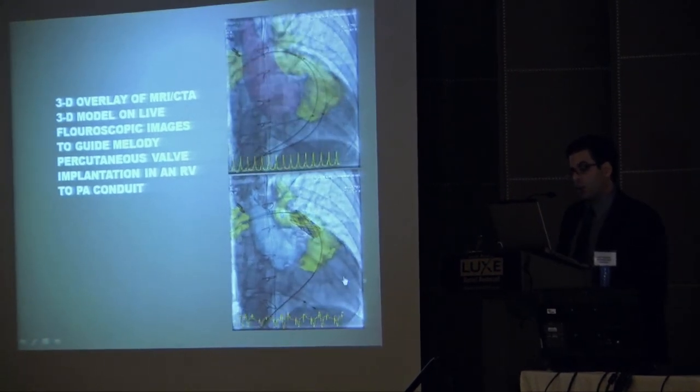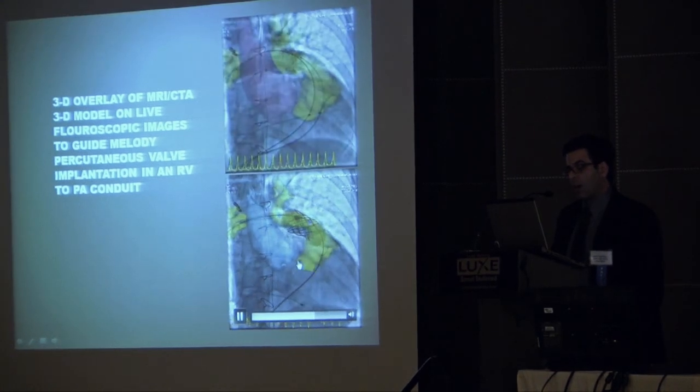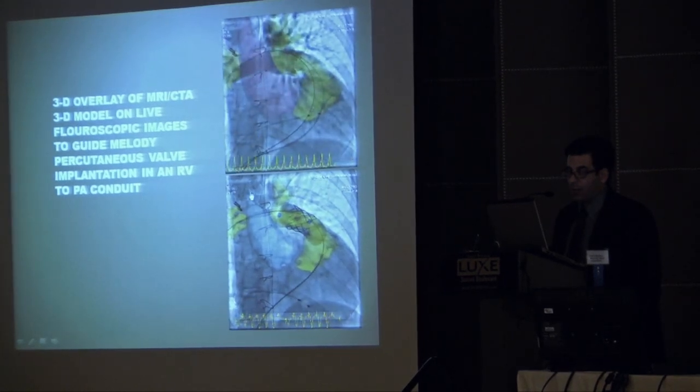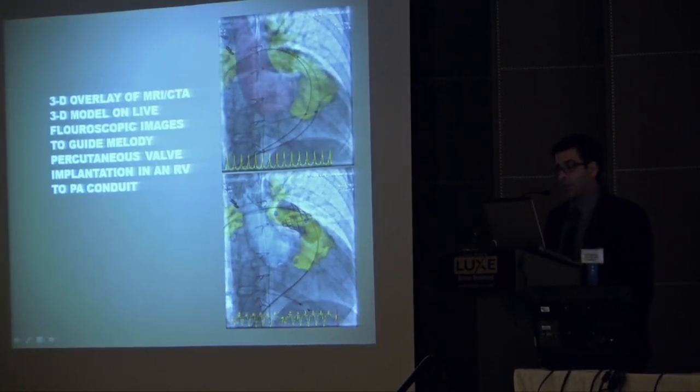And that way we make sure that we are not in any way impinging on the branch pulmonary arteries, and we're not hanging too far out into the RVOT. So nice stuff, and you notice here that in all of these, the patient is going 180 beats per minute here. So be prepared for a little ventricular tachycardia sometimes in a tetralogy patient.